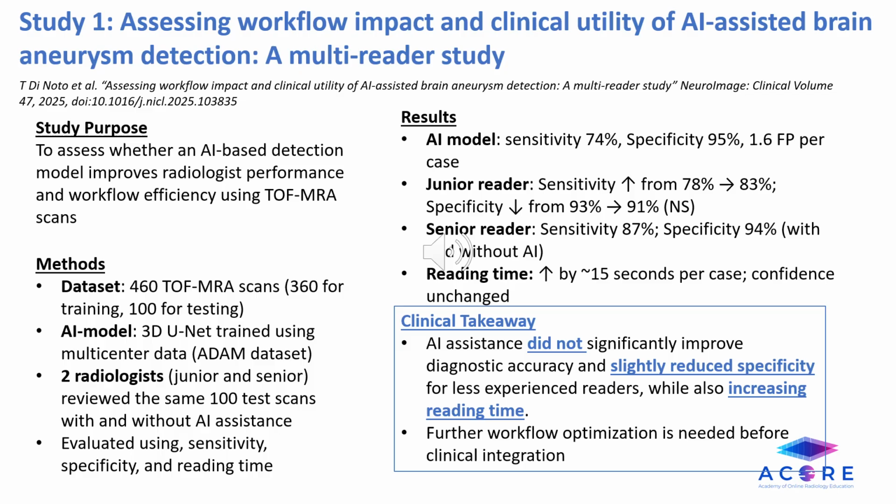So overall, AI did not significantly improve diagnostic accuracy and even slightly reduced specificity for less experienced readers, while also increasing reading time. This suggests that although AI holds promise, it still requires workflow optimization and clinical validation before being fully integrated into daily radiology practice.